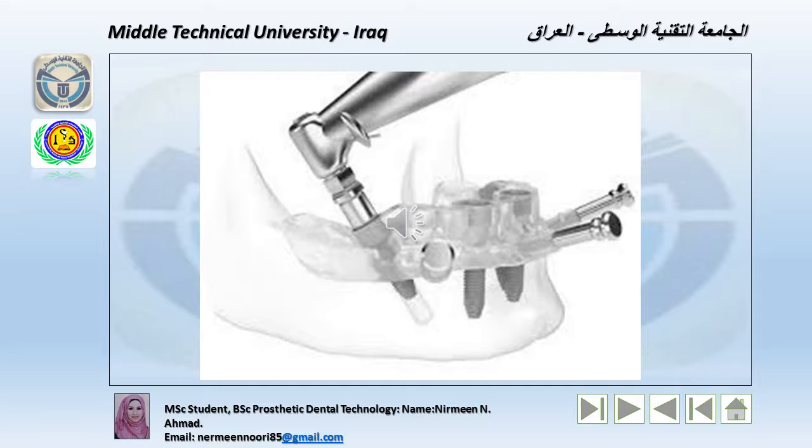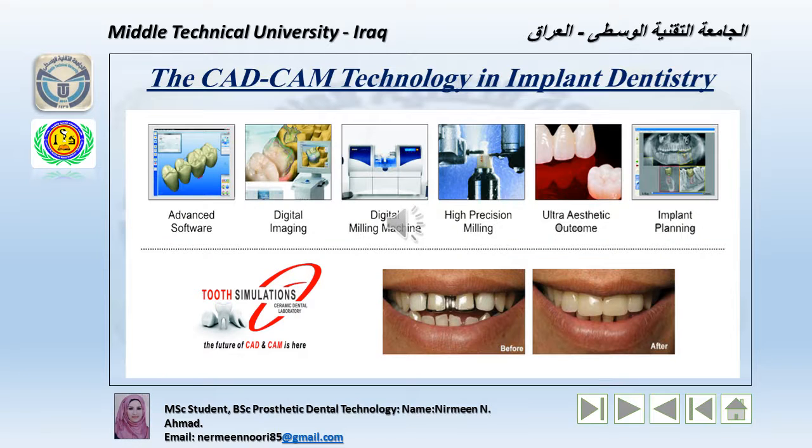Computer guided. The use of the CAD-CAM technique for manufacturing surgical drill guides assists the physical transfer of the implant planning to the patient's mouth, thus improving accuracy and visibility of the final implant placement. Our topic now: the CAD-CAM technology in implant dentistry.